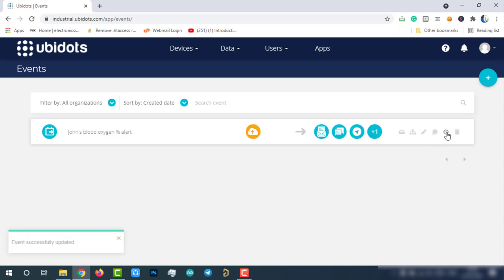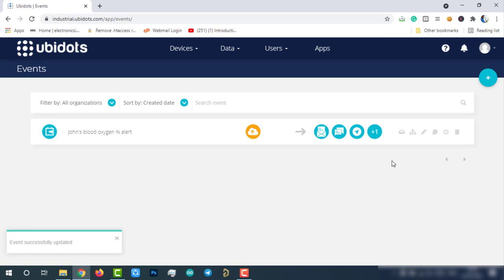Let's enable this event. Now everything is configured to get an alert whenever the SPO2 value is less than or equal to 95% for one minute. And also, we will receive another alert message whenever the value is back to normal. Let's test this feature now.